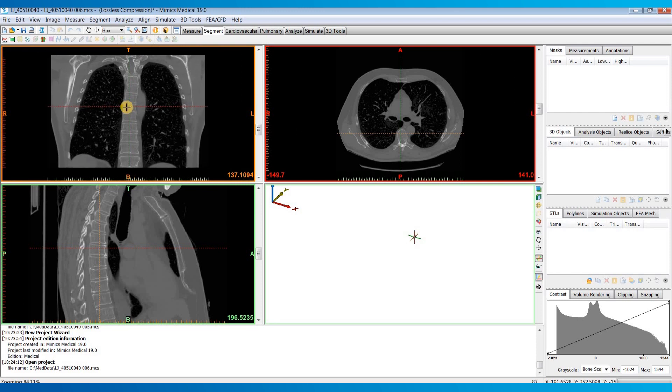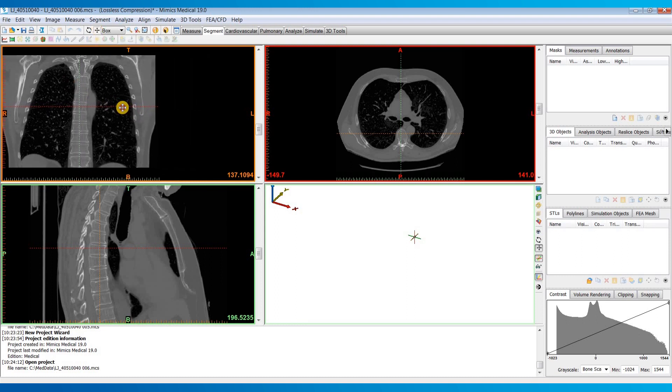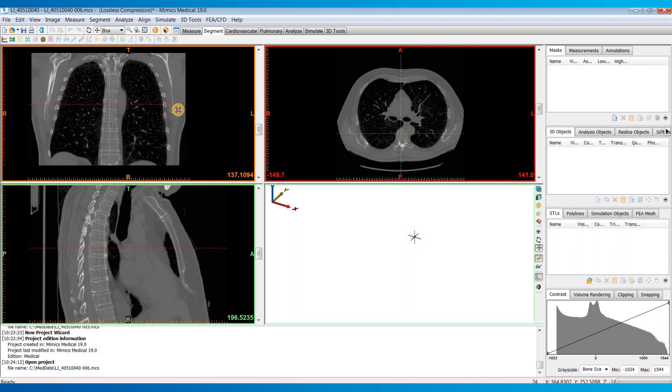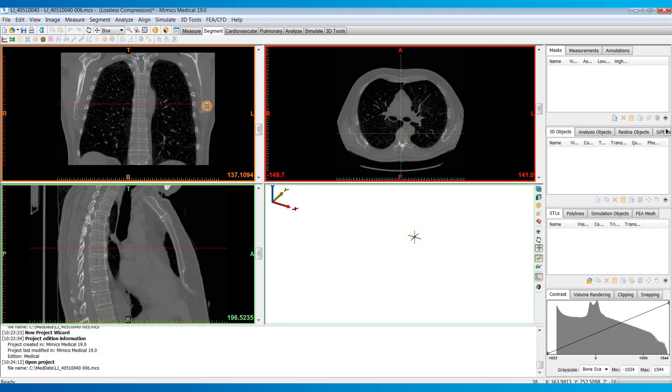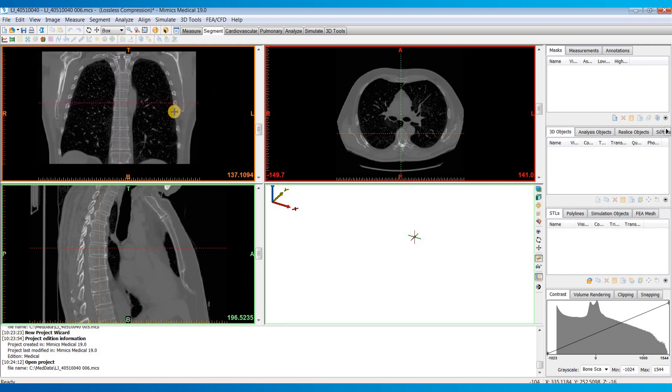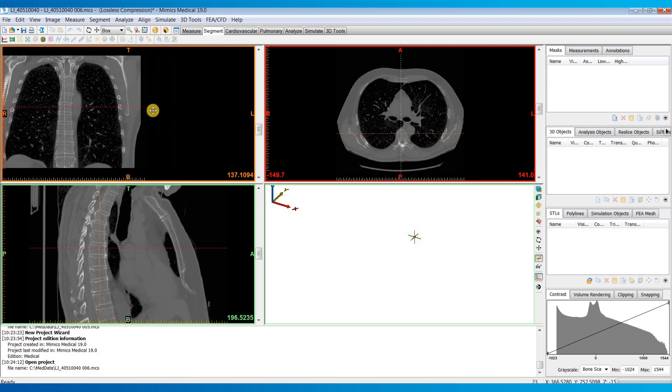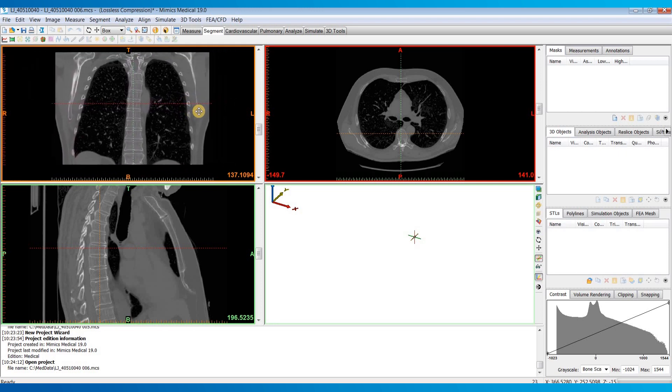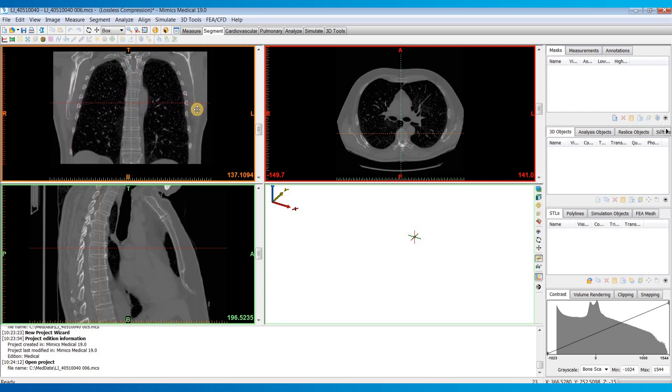To pan your windows you can select this pan button here and then hold down left click and drag your mouse around. Or for the shortcut if you have a scroll wheel on your mouse you can push in that scroll wheel and drag your mouse around to pan around in the images.